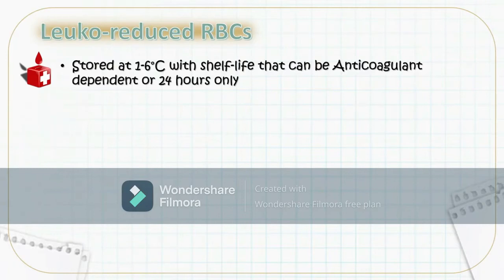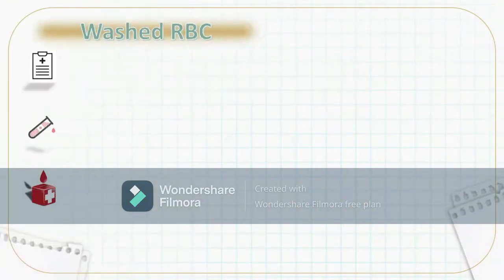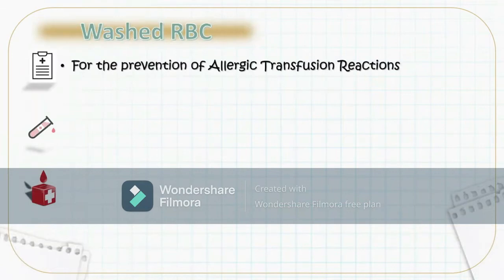an open system. Next, we'll have our washed red blood cell units. Now, these units are primarily indicated for the prevention of allergic transfusion reactions, which occur once the recipient contains anti-IgA antibodies.